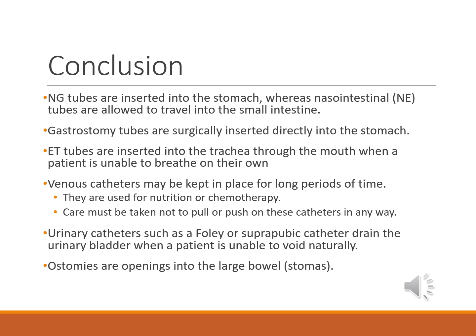Mechanical ventilators are used to support respiratory function. It's important that you handle them with care, and they should never be disconnected from the power source. Imaging patients on ventilators can be a challenge, and you may require the assistance from the nurse when imaging a patient in their room. Typically, these patients are imaged using mobile radiography in the ICU, which is the intensive care unit.